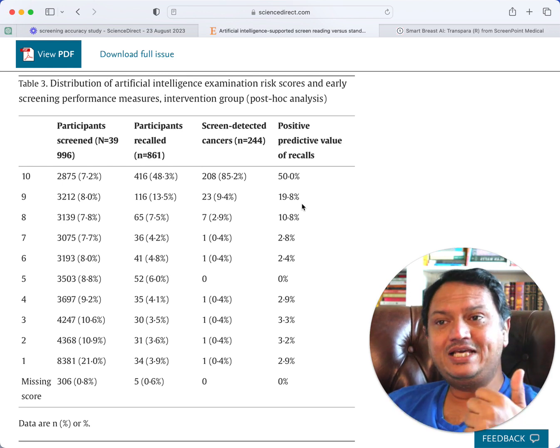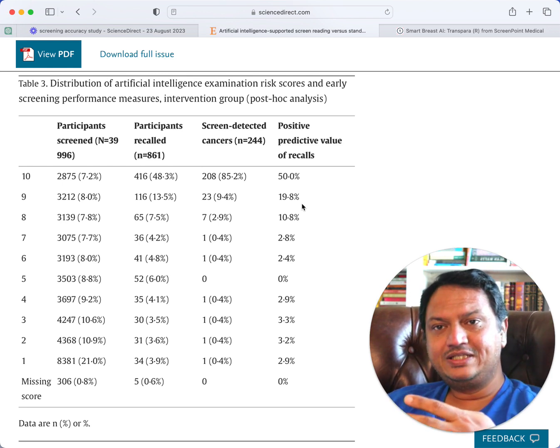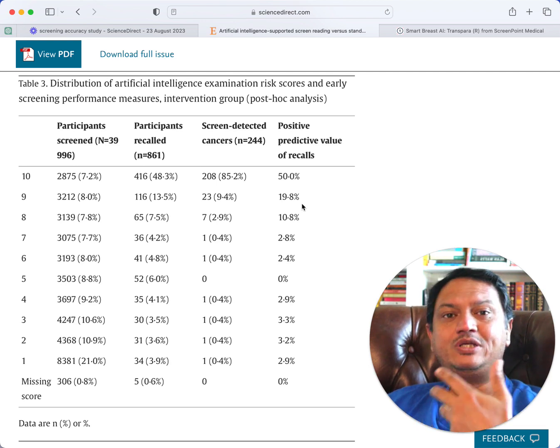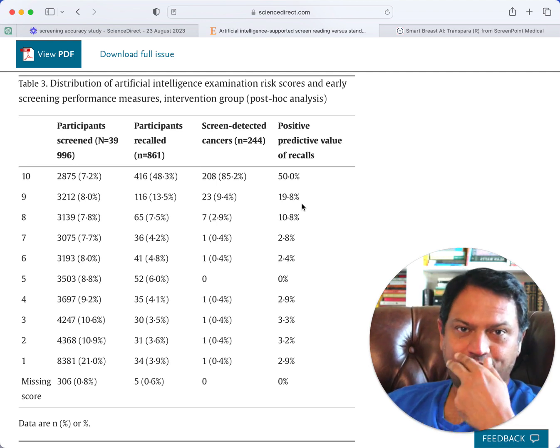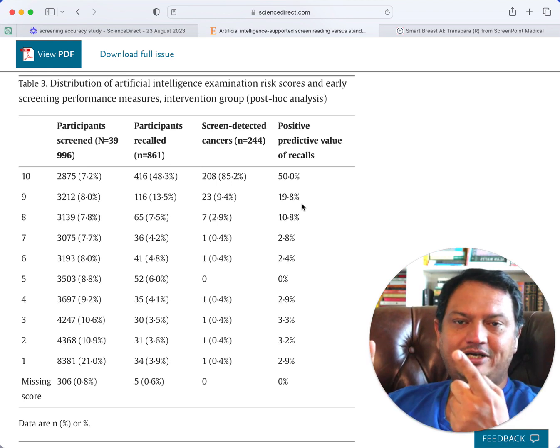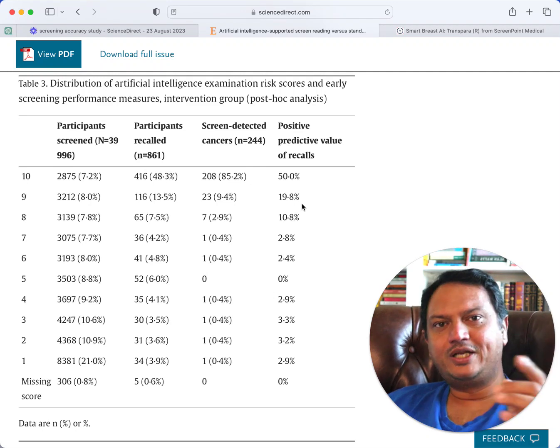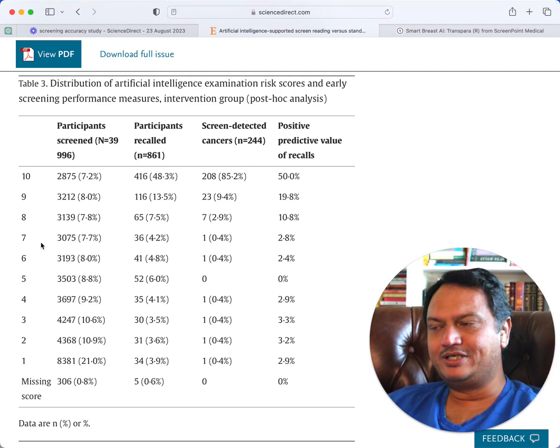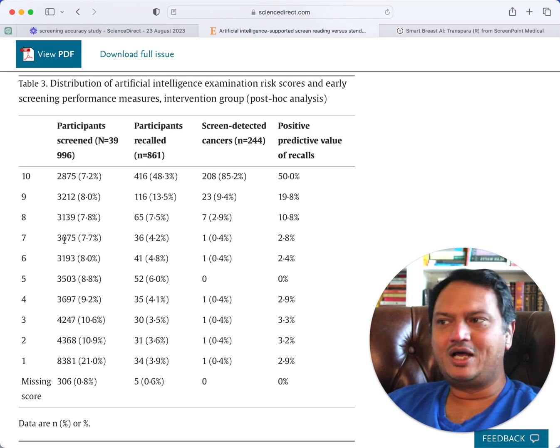Now, it may be that as AI gets better, and you keep the radiologists with the AI, they will eventually start beating the two radiologist group. So it's almost like radiologists alone, but yes, there are two independent radiologists, two independent minds, compared to one radiologist and one AI. Eventually, it may start beating it, but I don't know, it may also depend on how you design it.